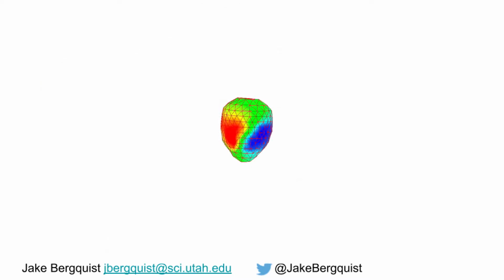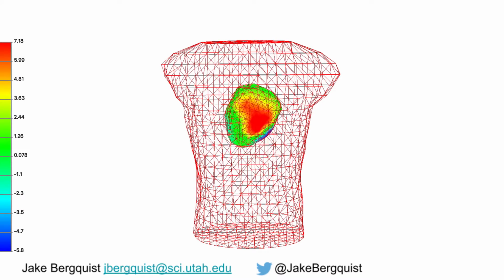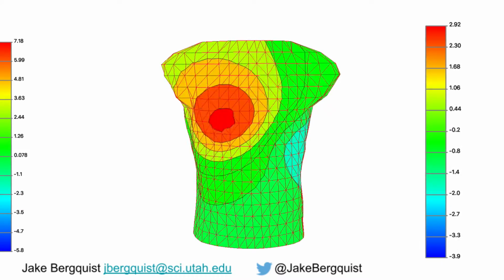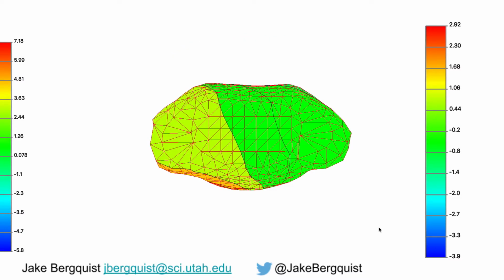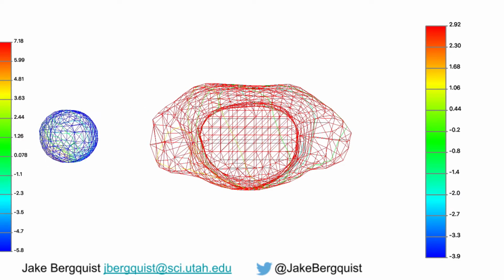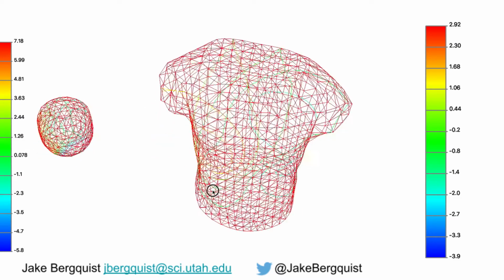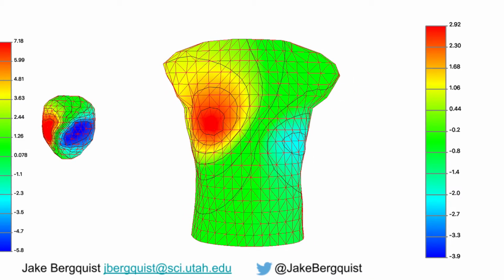Let's take a look at an example here where we have a cardiac geometry and the extracellular potentials measured during the peak of the QRS mapped onto it. Let's see what happens to the predicted forward model results on the torso surface as we move this cardiac geometry to different locations within the torso. Notice what a drastic effect changes in the cardiac position can have on the forward model solution. Let's take a moment to watch that again, both observing the changes in the cardiac position and the resulting changes to the forward computed body surface potentials.